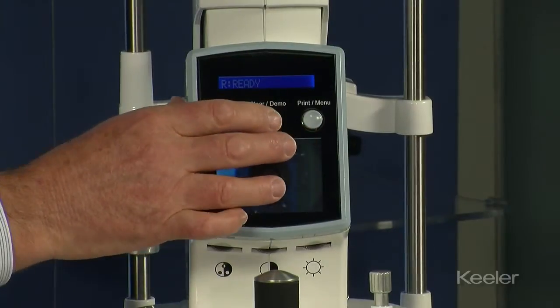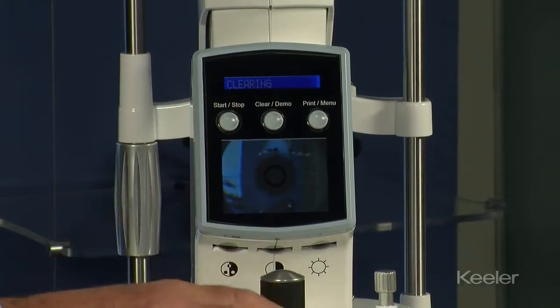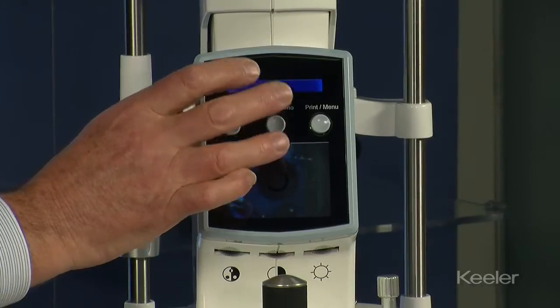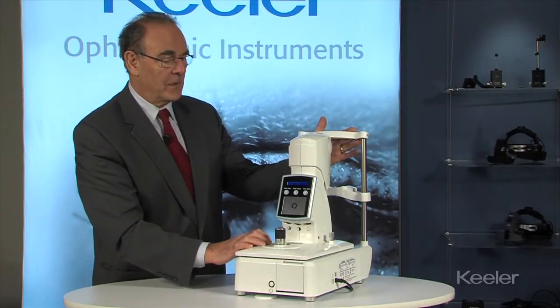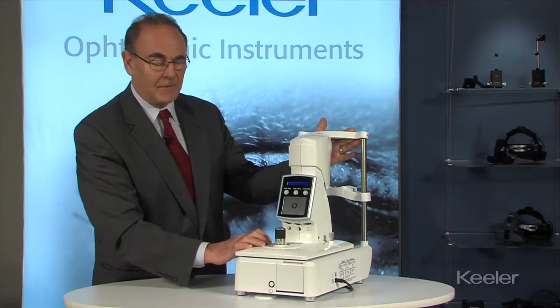The centre button has clear and demo functions, so you can clear the memory in the instrument. Also, if you hold the button in it will do a demonstration puff for the patient — they can hold their hand in front of the instrument and get some idea of the intensity of the puff.